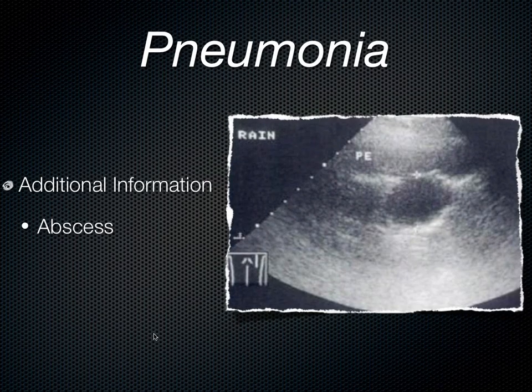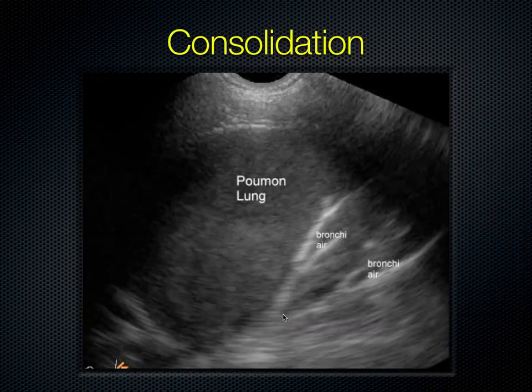Ultrasound's also been used to identify abscess within the lung. It's usually very circumscribed and discrete, sometimes with some fibrin or exudate in the dependent area. Here's a great example that one of our French-Canadian colleagues offered, of the air bronchogram, the bronchial tree visible within the lung.